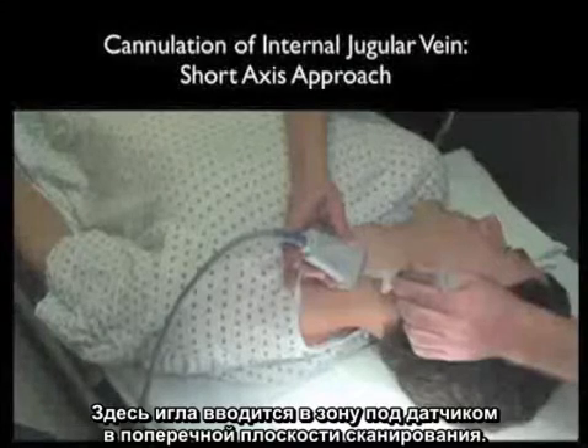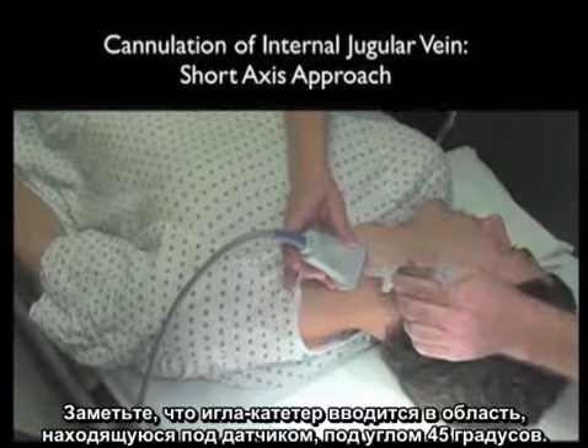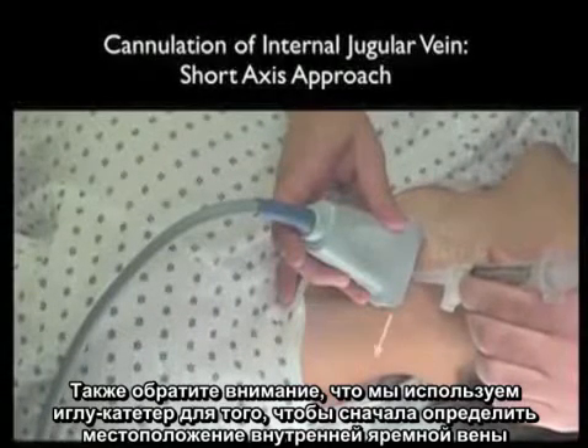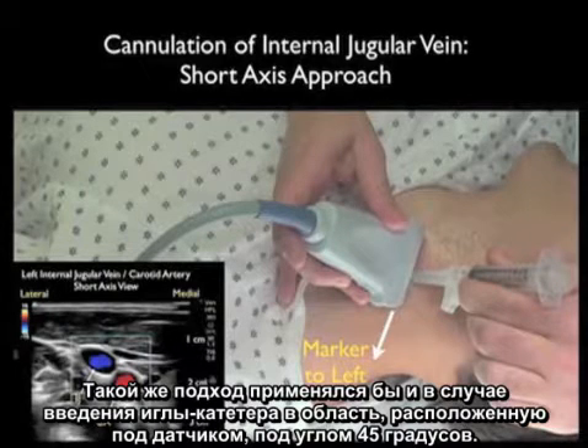Here's a needle coming in underneath the probe in a short axis configuration. Notice that the sheath needle is coming in underneath the probe at a 45 degree angle. We're using the sheath needle to first determine the location of the internal jugular vein by the ring-down artifact. We would use the same approach for the cannulating needle coming in underneath the probe at a 45 degree angle.